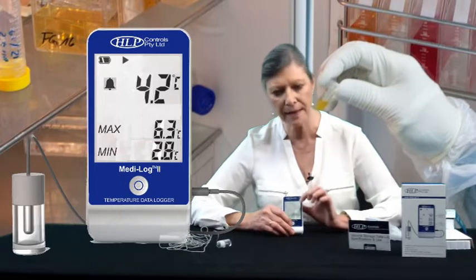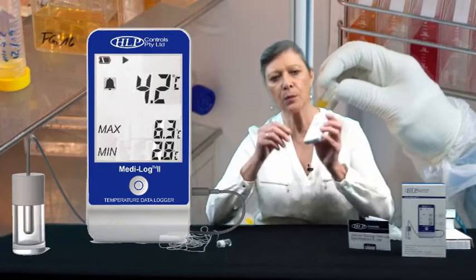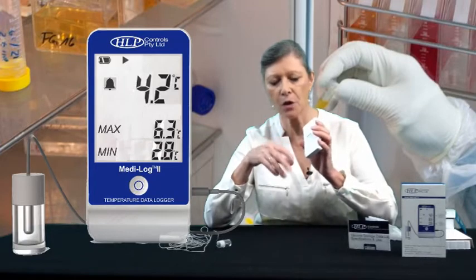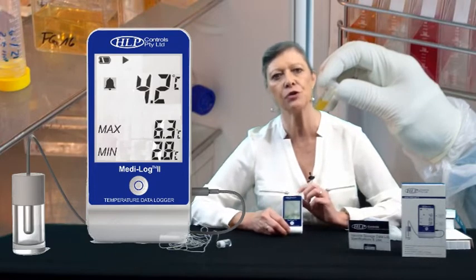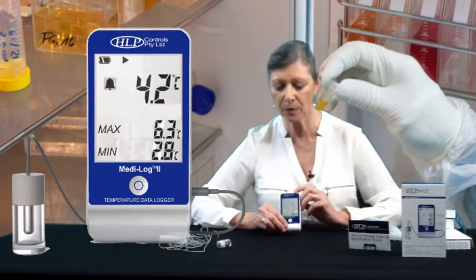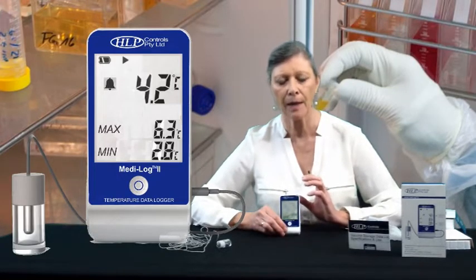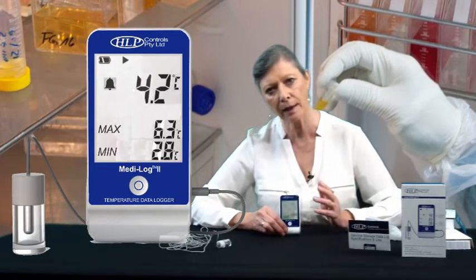The probe temperature and the min/max temperatures are always displayed on the home screen. It has a replaceable 3.6-volt battery located in the back — you can easily replace that yourself, and it should last about a year. It comes ready to use, already set with the Department of Health's two-degree and eight-degree alarm points. If you're using this for food storage, you can easily change that yourself — for example, to five degrees as the high alarm and a low alarm of whatever suits the food you're storing.